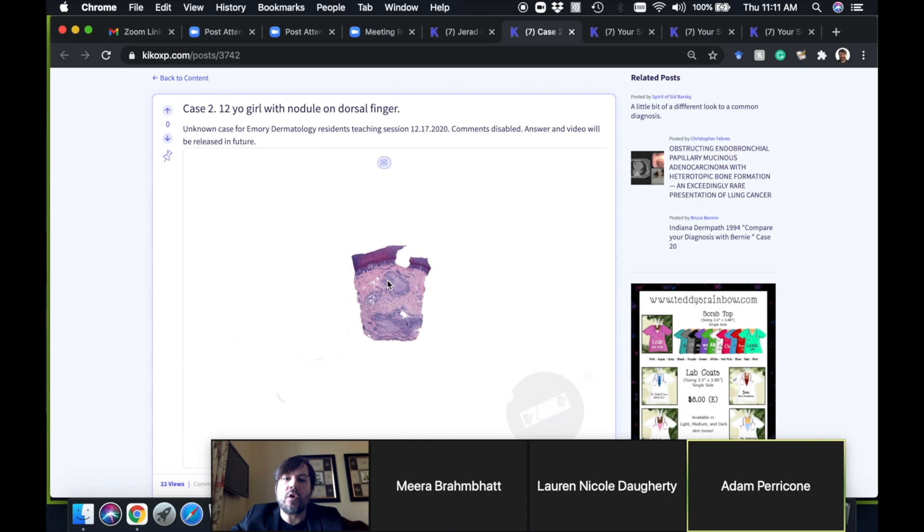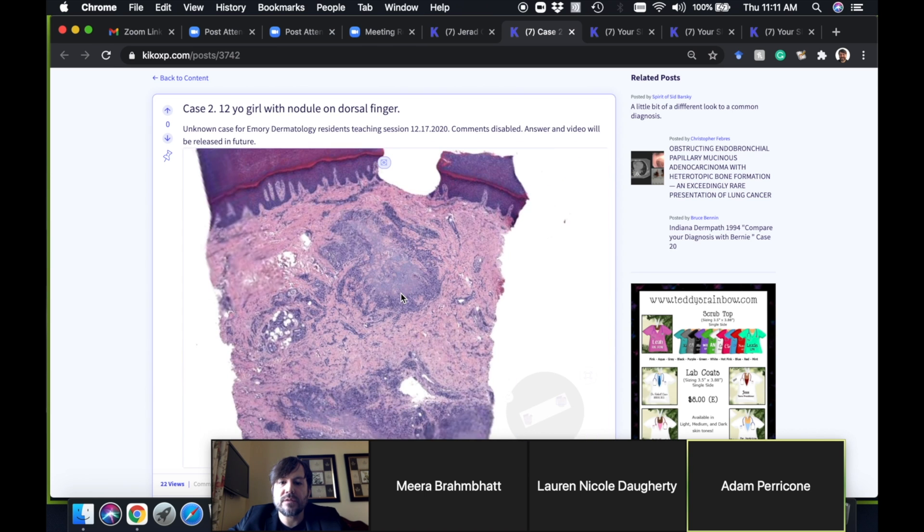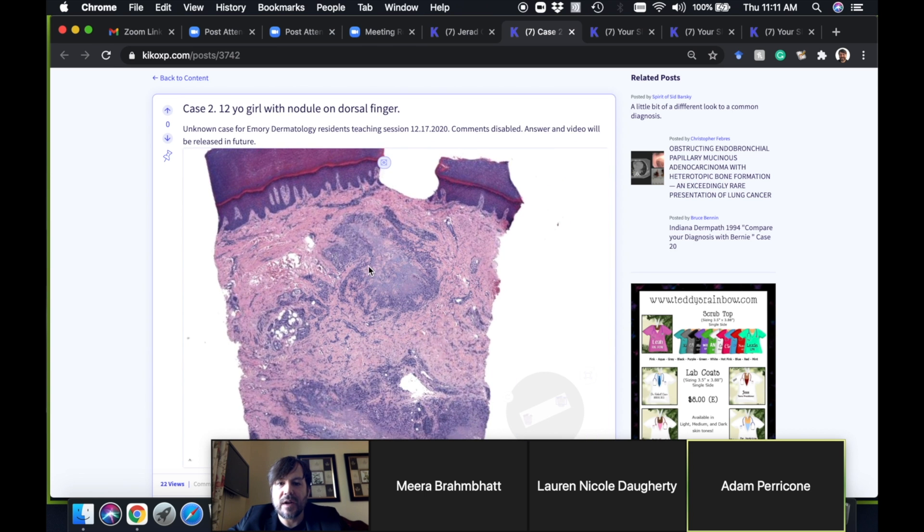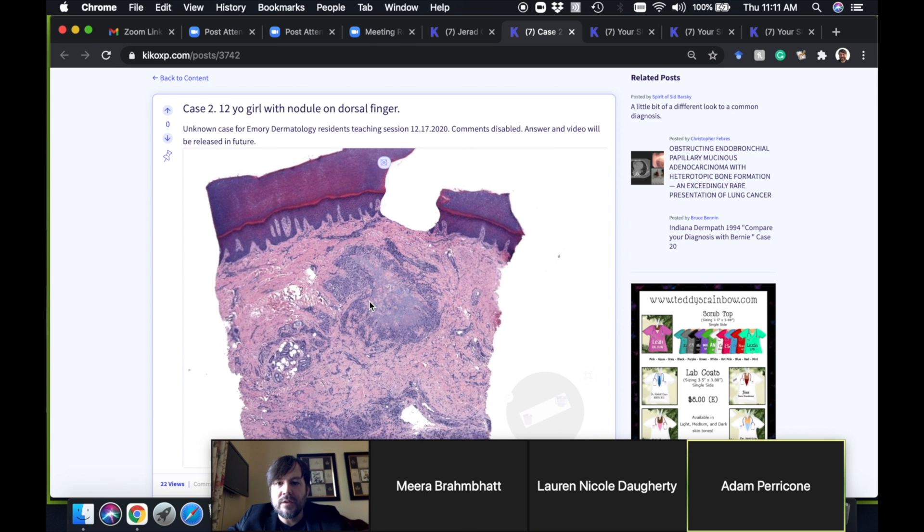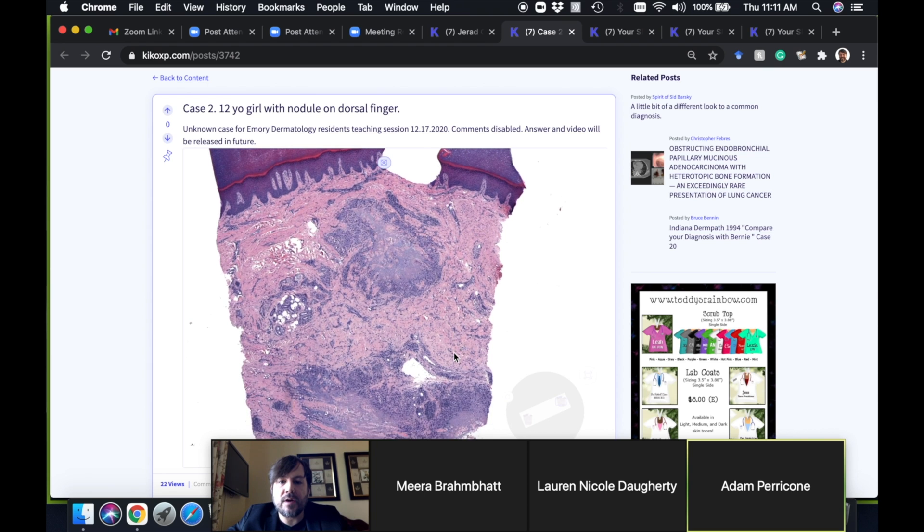Here we have a 12-year-old girl with a nodule on the dorsal finger. You can see we're on acral skin. Does anyone want to take this one and tell me what they think?